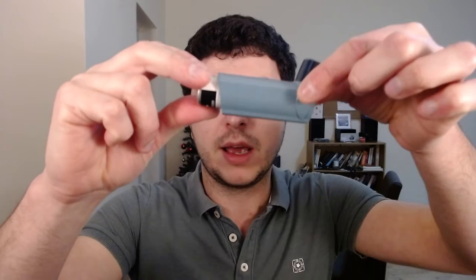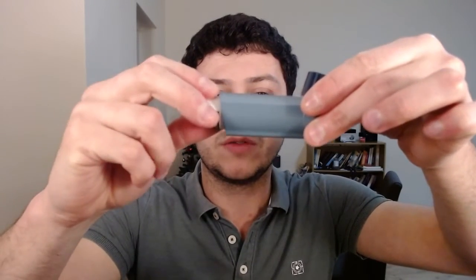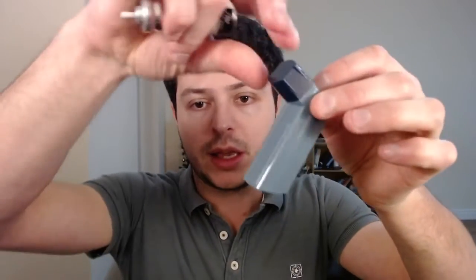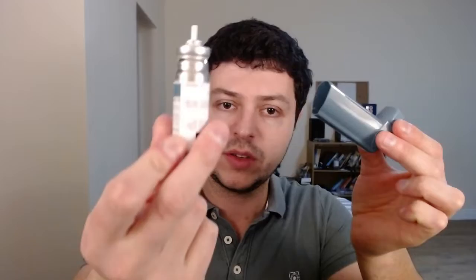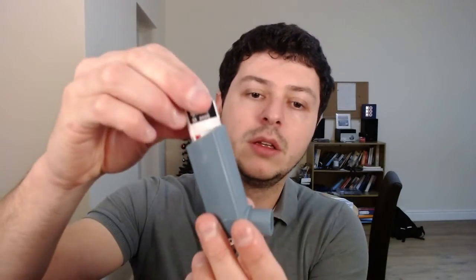Looking at the inhaler, it contains the active compound — the actual Ventolin. I'm going to be testing it on myself in this video since I don't have a demonstrator device. You've got this thing that has a cap that you can remove, and the canister that contains the medication goes inside. You pop it in and force it until it clicks into place. When it's assembled like this it's working, and you can puff it in the air and see a mist coming out.